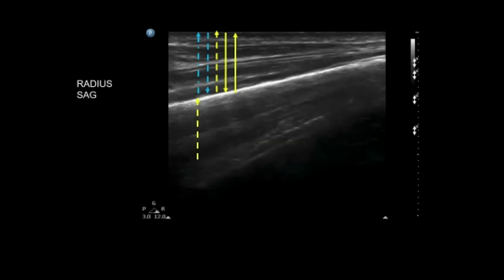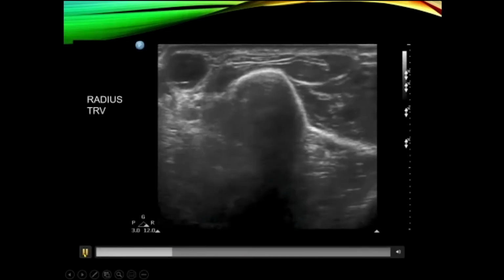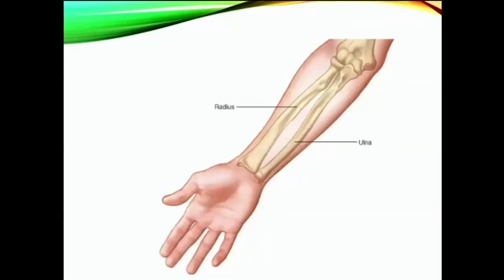So scanning, you're going to scan the cortex, of course, in sagittal and in the transverse plane. And that was a radial in the sagittal view, and this is the radial in the transverse view. And it's interesting to note that everybody thinks, oh, these bones are kind of flat. But in fact, if you look at the anatomy of the radius, you'll notice that it has this actual groove in it. So you'll see that on ultrasound as well. So you kind of have to know the normal anatomy of your bones as you do these scans.